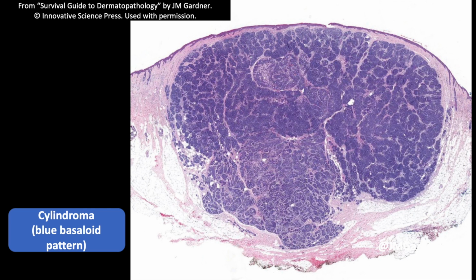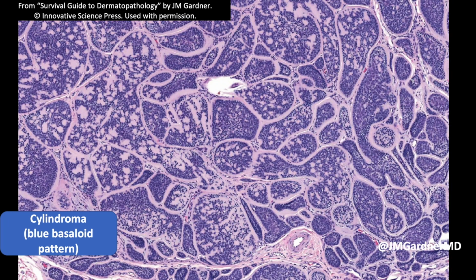And when I see that, I say spiroadenoma/cylindroma hybrid tumor. And with a comment, if it's not a dermatologist, I'll add a comment that this is a benign sweat gland neoplasm, just so they're familiar that it's nothing scary, even though it has a weird sounding name. All right. So the difference is that cytologically, cylindroma and spiroadenoma to me are essentially identical or very similar to each other. The difference is in the way the cells are arranged with one another.